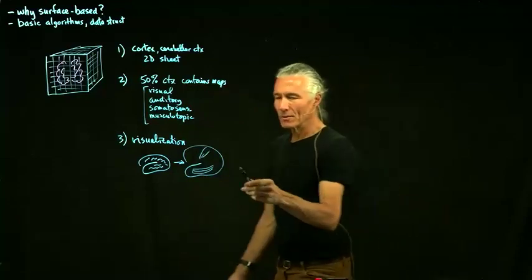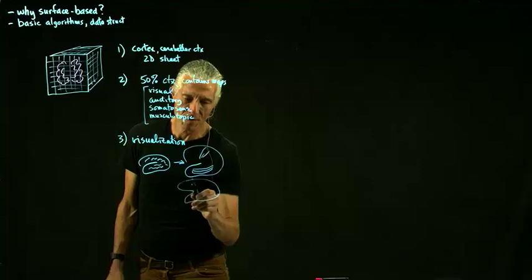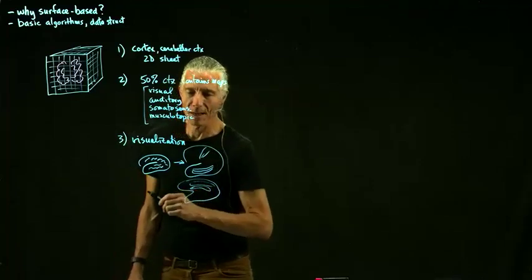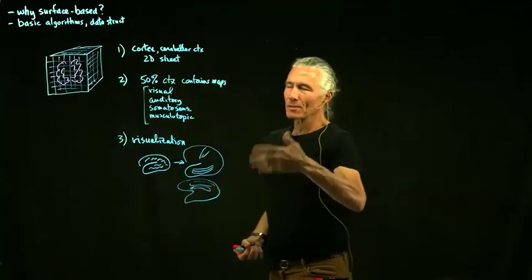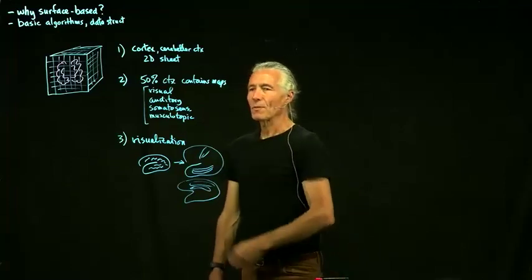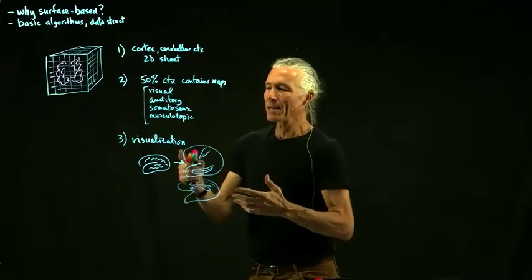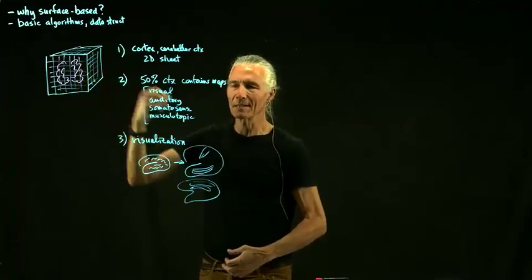Well, you still need at least two views. You'd have to turn it around to the midline to see what's on the midline. But that's a lot better than cutting through 100 slices. So that's another basic thing for just looking at brain data. It's a pain in the butt to have to page through 50 slices.